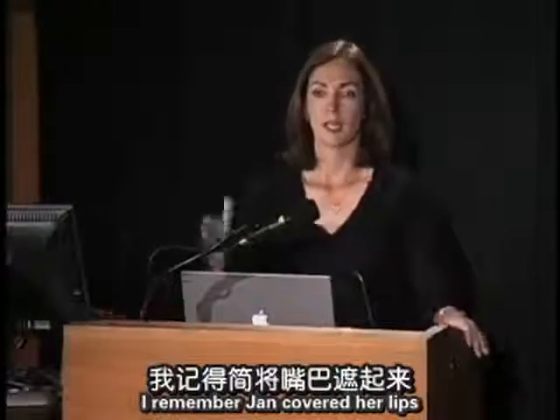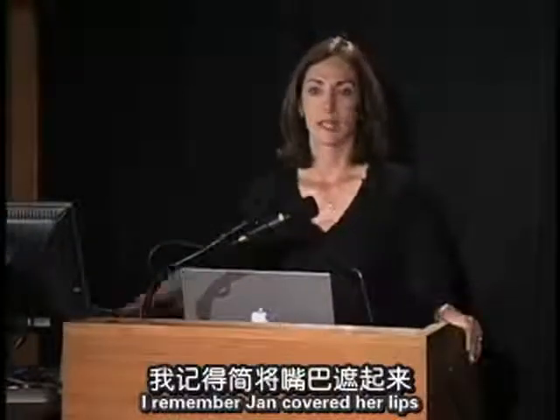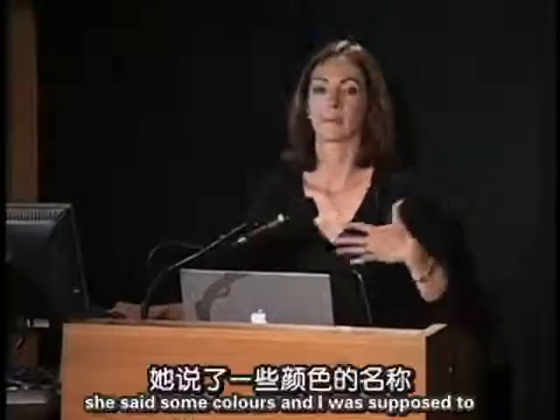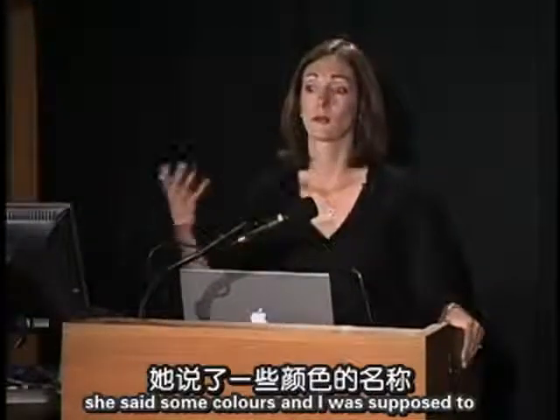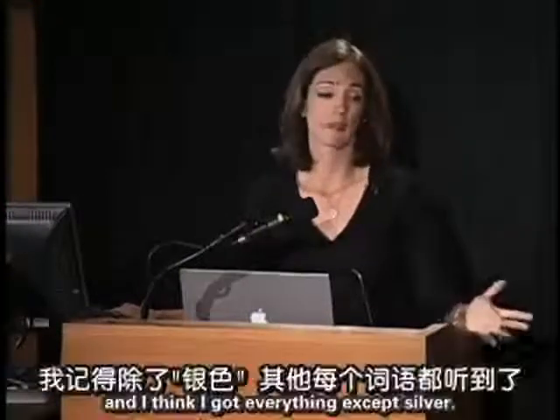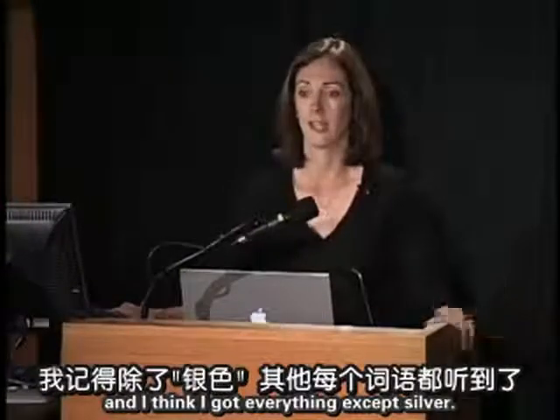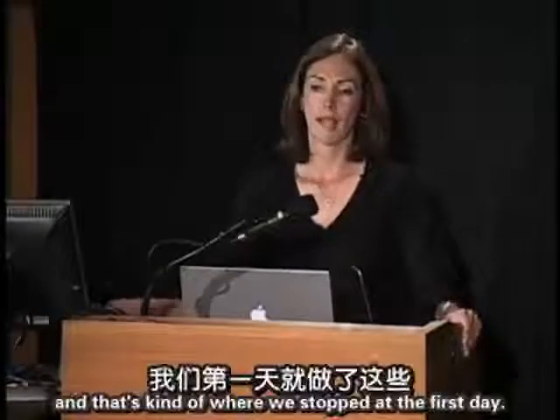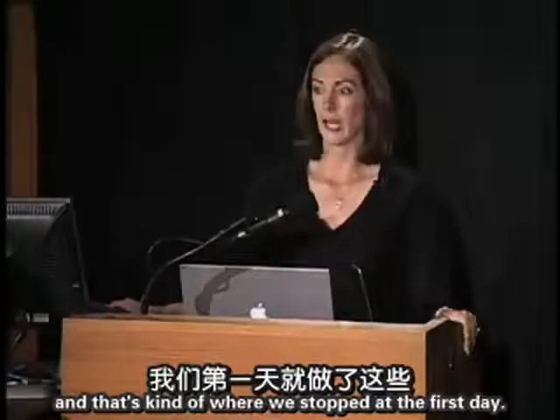I remember Jan covered her lips, and she did some testing, and she said some colors, and I was supposed to repeat back the colors, and I think I got everything except silver. And then she said the days of the week and the months of the year, and I was able to get it very well. And that's kind of where we stopped at the first day.